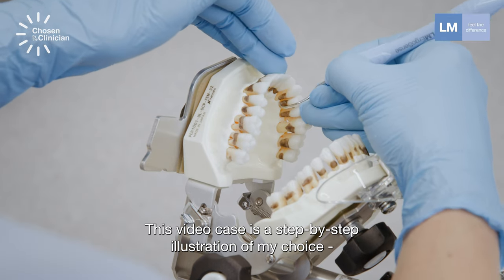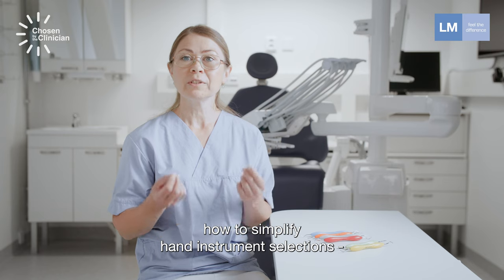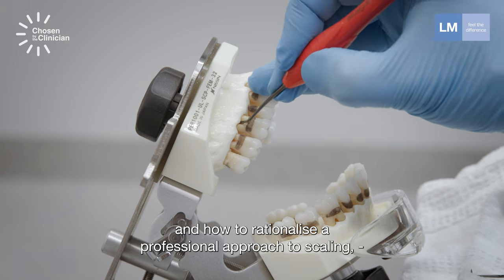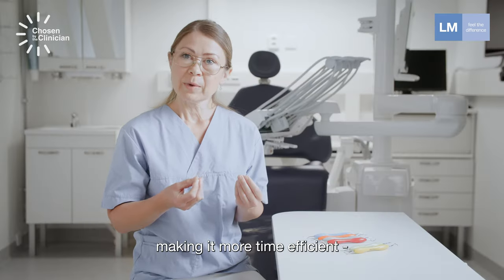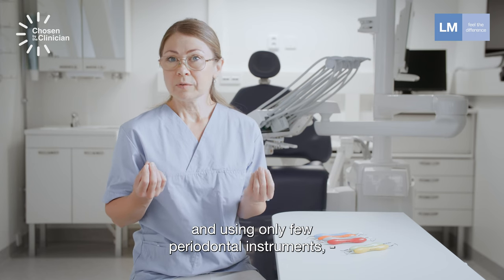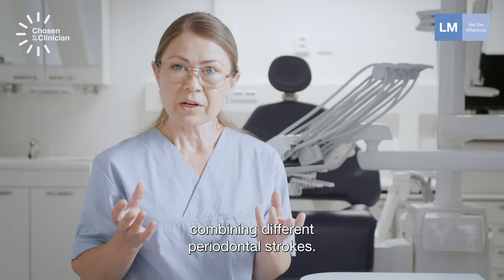This video case is a step-by-step illustration of my choice: how to simplify hand instrument selection and how to rationalize a professional approach to scaling, making it more time-efficient and using only a few periodontal instruments, combining different periodontal strokes.